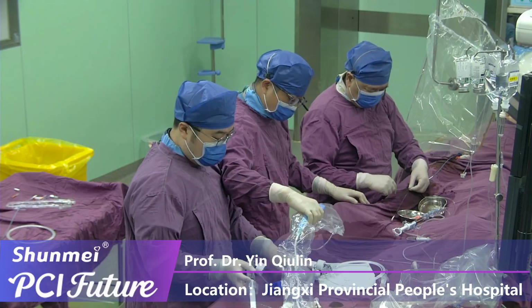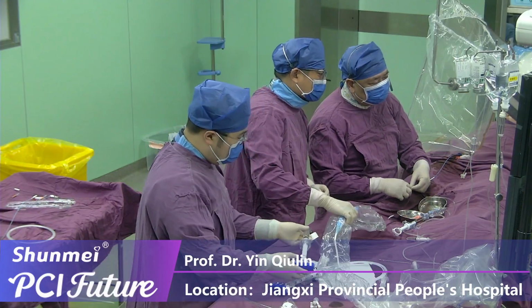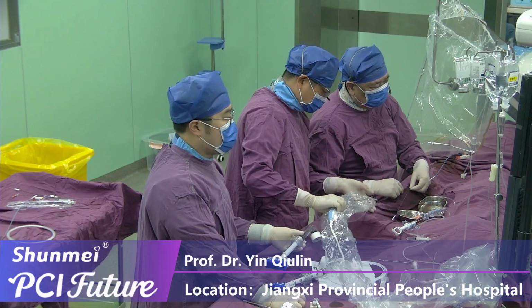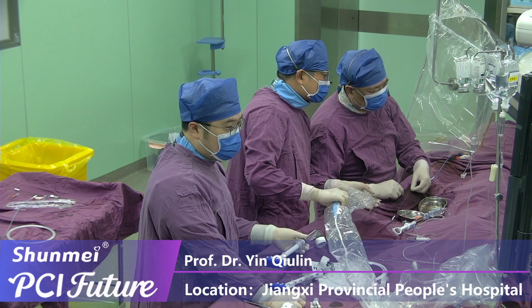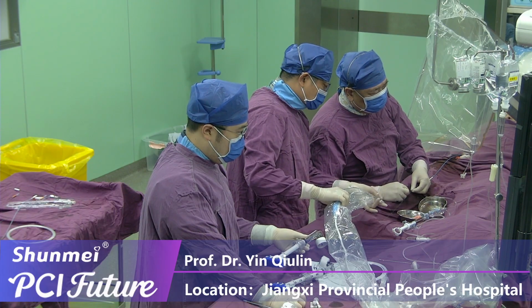RCA, diffuse stenosis with calcification throughout the vessel, approximately 98% diffuse stenosis near the trifurcation. His past history was hypertension, coronary heart disease, history of PCI, and the diagnosis would be coronary atherosclerotic heart disease, hypertension, type 2 diabetes.